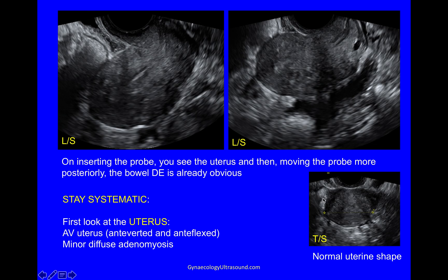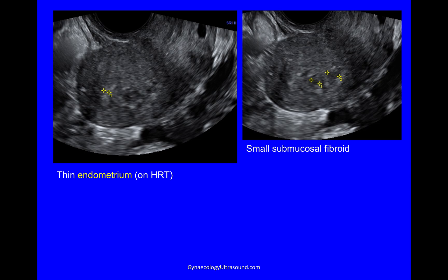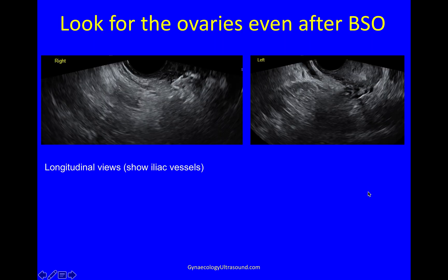Looking at the transverse plane, the uterus is a normal shape, which I judge by the shape of the endometrial cavity. Then looking at the endometrium, at the endometrial thickness — I will have had better views throughout but this is where I'm measuring the endometrium. It's nice and thin on her HRT, and here there was a small submucosal fibroid. Even though I knew she'd had a BSO, I still look for the ovaries in the longitudinal view because that shows you the iliac vessels, and in both annexae you can see there's no ovary.